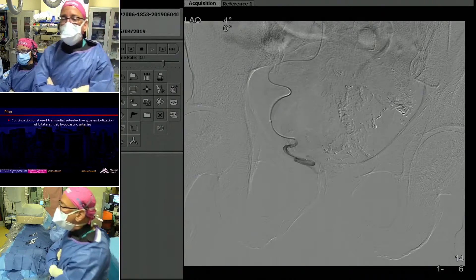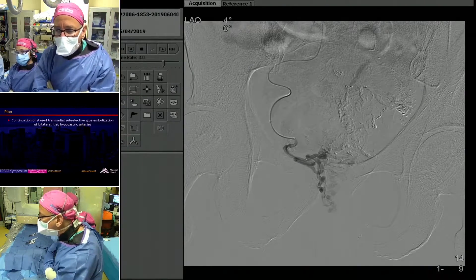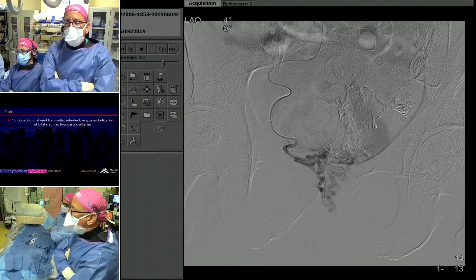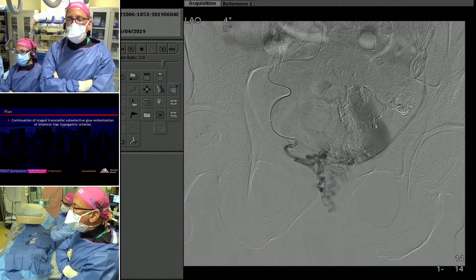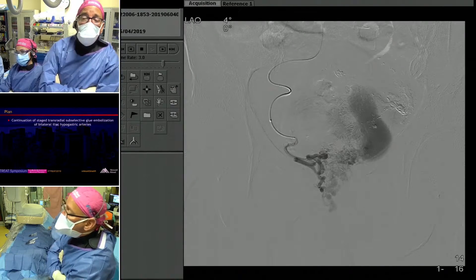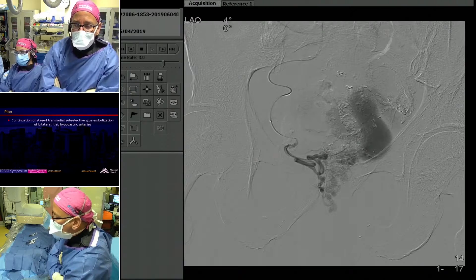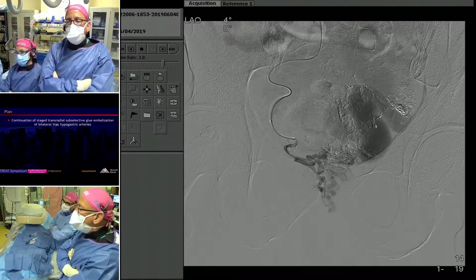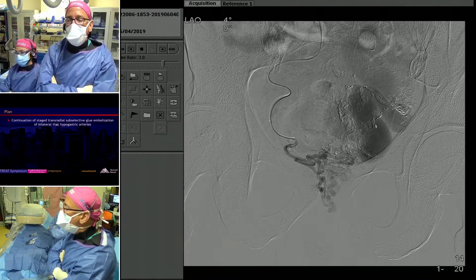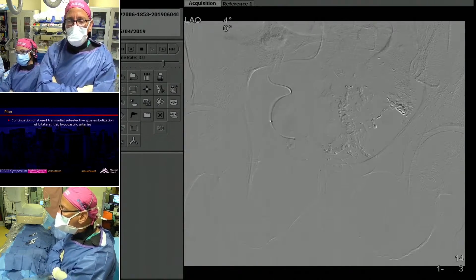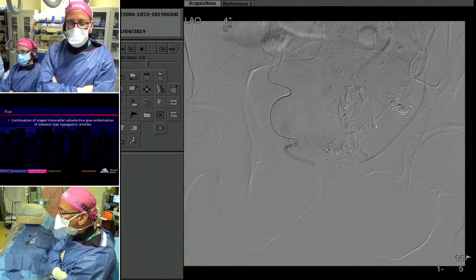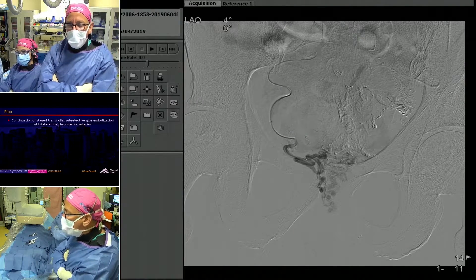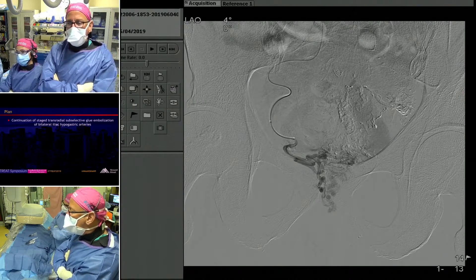I'm not even sure what to name this artery, but we feel that we're in a good location right now — it might even be the prostatic, to be honest — to be able to do a trans-arterial embolization with NBCA tissue adhesive.